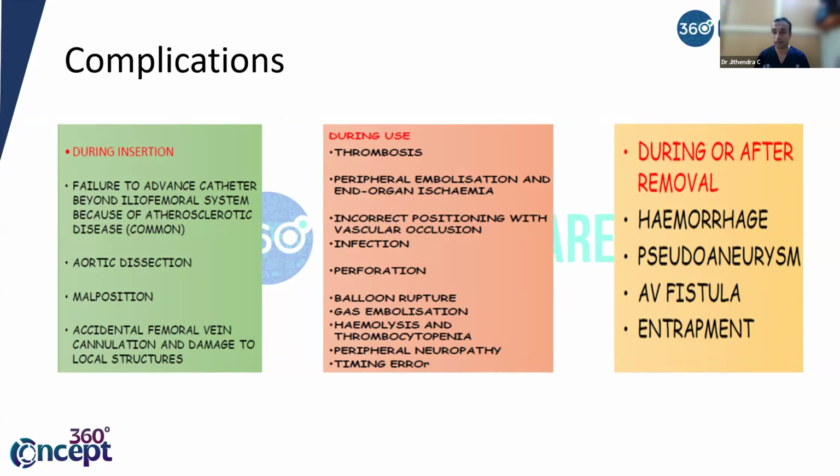After removal, what can happen? Yes, obviously you punctured a big vessel, removed a big catheter, so there is risk of bleeding. So complete occlusion, 20 minutes. Pseudoaneurysm can happen, fistula can happen. Sometimes your balloon can get entrapped. You kept the balloon for a longer time, some calcification has happened, so there is already a calcified vessel, some thrombosis can happen, atherosclerosis can happen, that can trap the balloon. That is also a very, very rare complication, but that can happen.